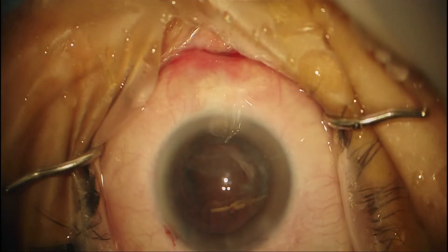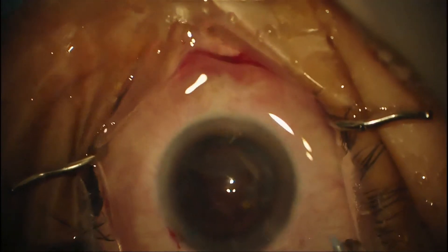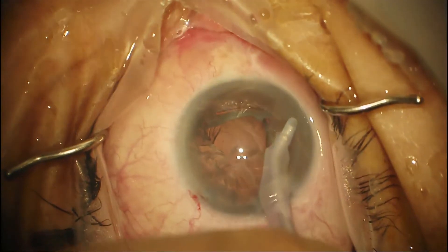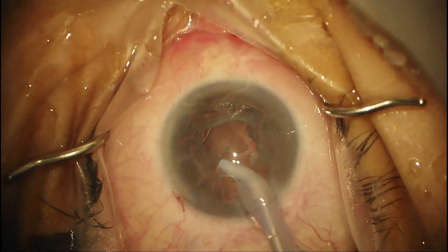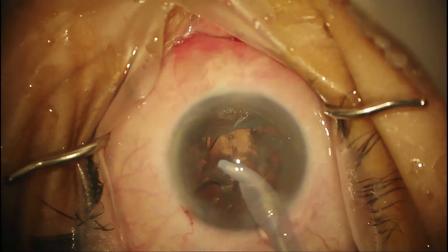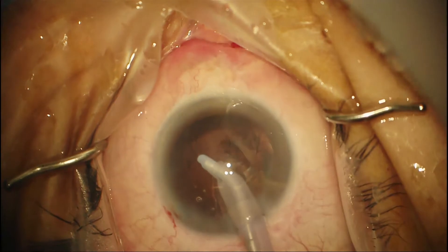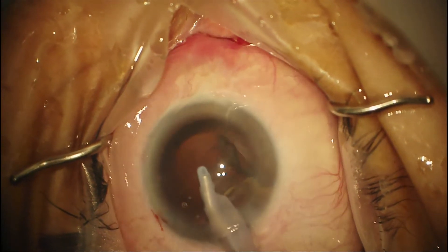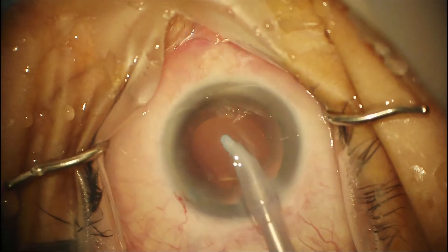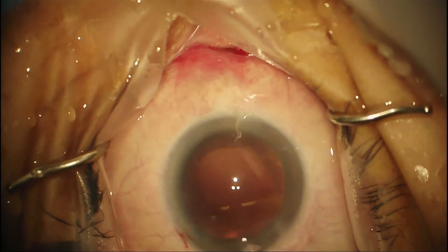We're done with the phaco part. There seems to be an epi-nucleus and cortex remaining. The I/A tip I use is 45-degree with a silicone tip — it makes things very gentle and easy with low risk of damaging the posterior capsule. When I entered the eye there, I reached under the iris — there was some deepening of the AC that can happen in myopic eyes and I wanted to break up that anterior capsule iris block. This is pretty friendly cortex; it looks like it's coming to the tip easily. I'm getting all the little remnants, vacuuming the capsule — the posterior capsule looks clear with no remaining cortex.